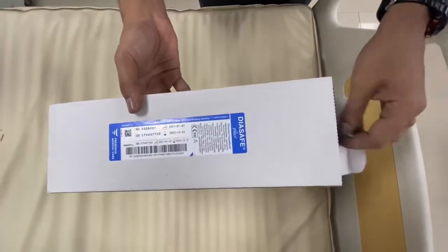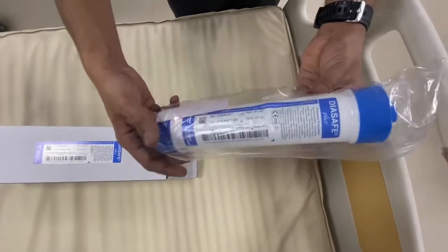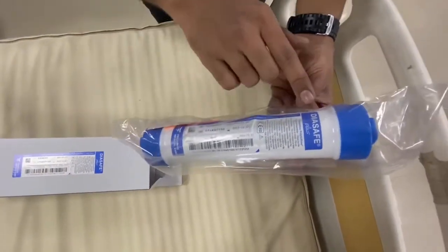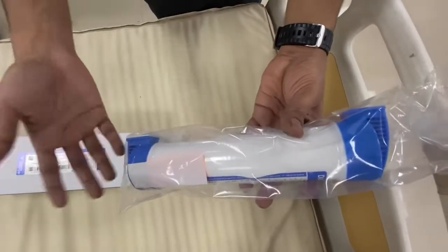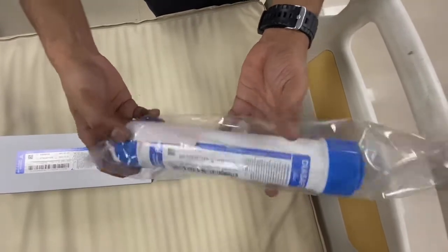This is the dialysis fluid filter used in a dialysis machine. It is made by Resinius company and the price is approximately 6000 rupees. It has only two ports — it is not the dialyzer. In MD spotters, students often get confused between this and the dialyzer.